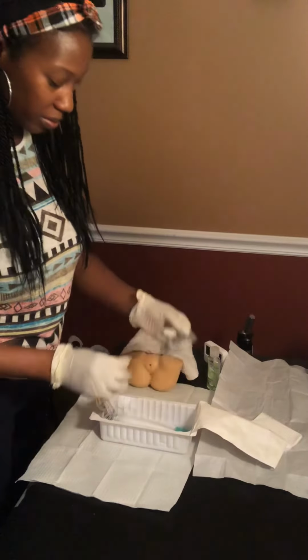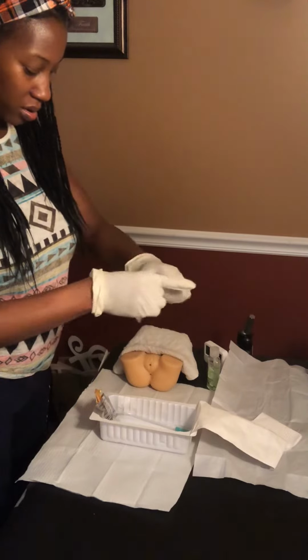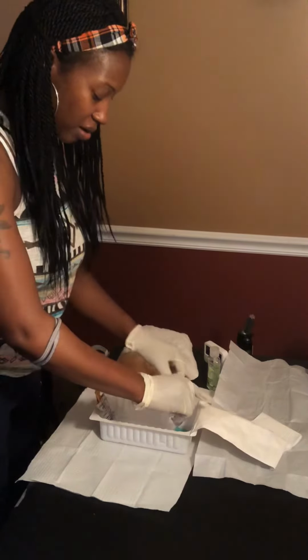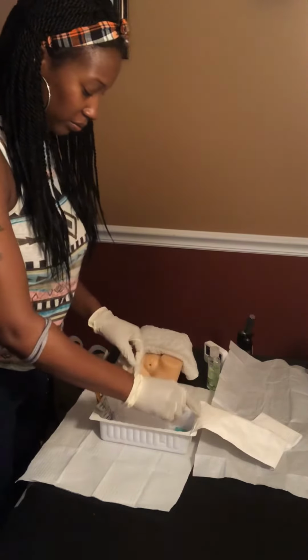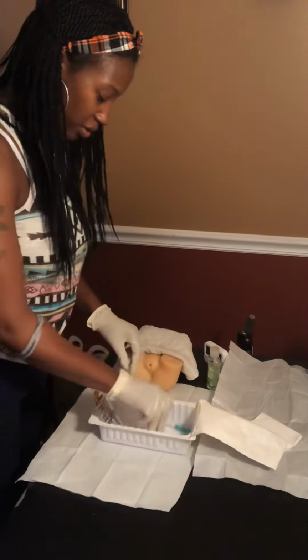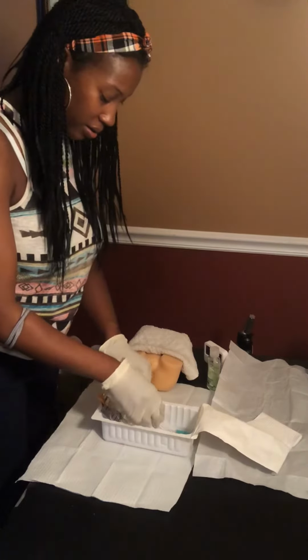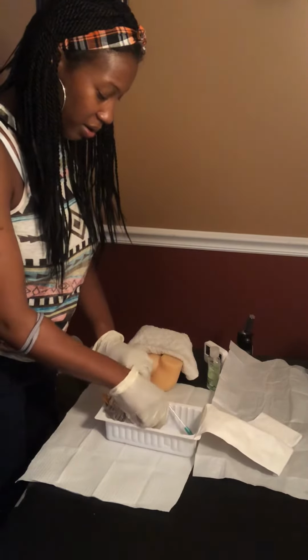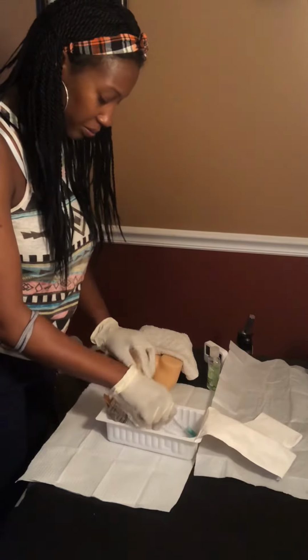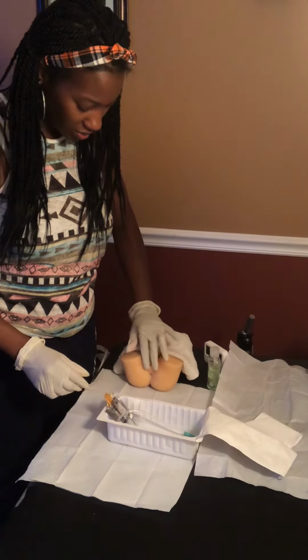You want to open up your lube. Squeeze it in there. Drop that in the trash. Get the end of your catheter in the gel. Take your non-dominant hand. Spread the vagina.